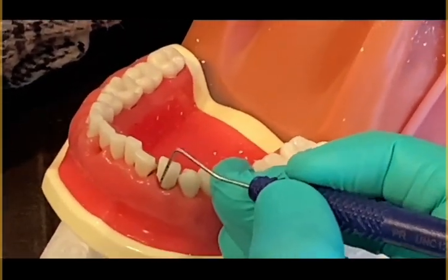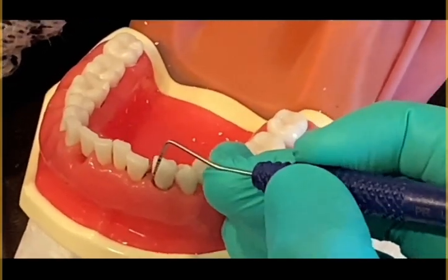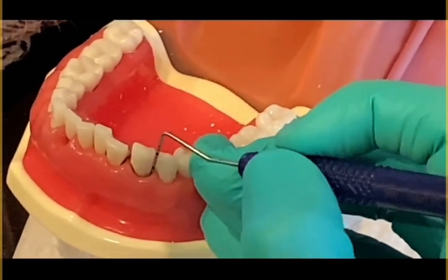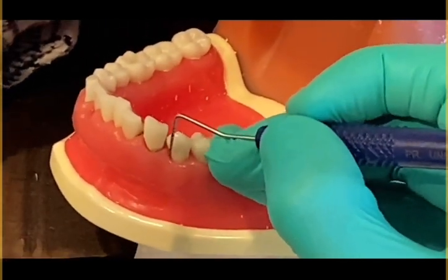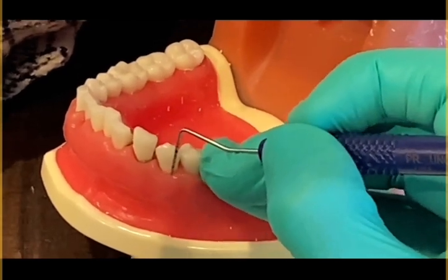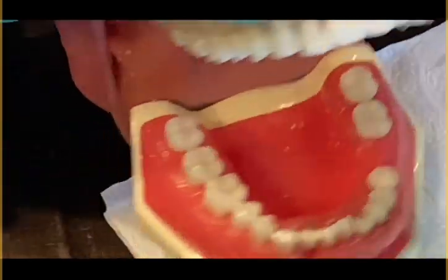It's 22. 3, 4, 3, 4. Coming around on the lingual.